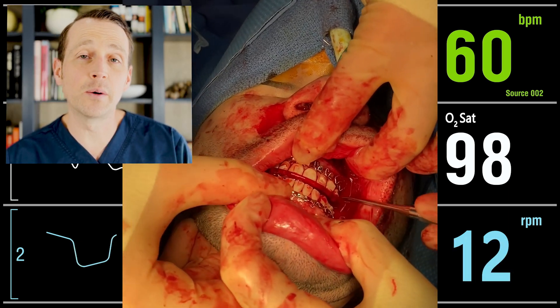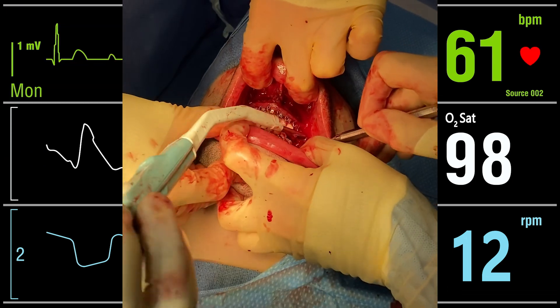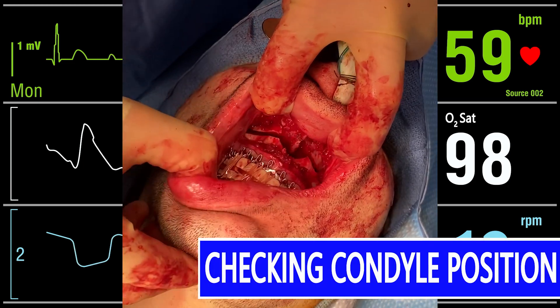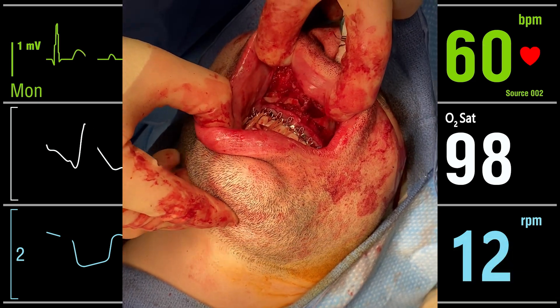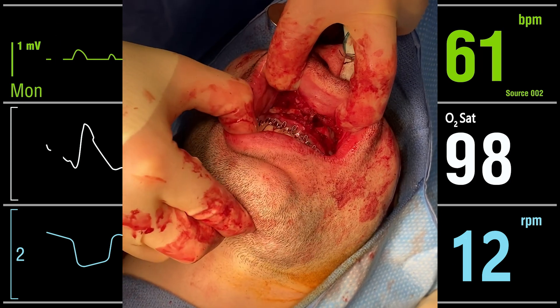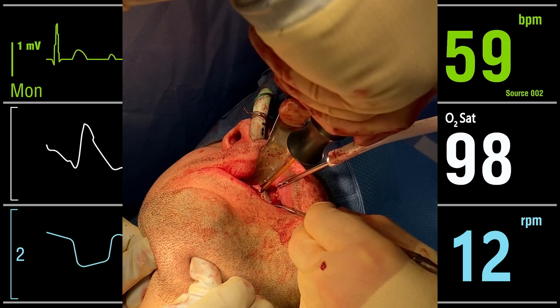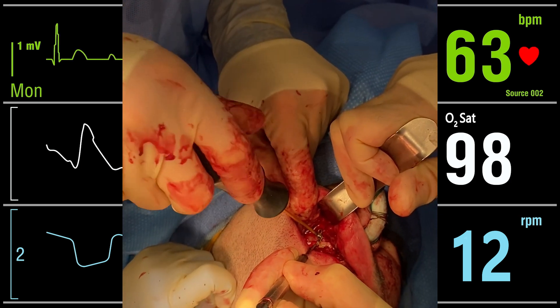I can advance the maxilla without resistance and it fits into the splint passively. I lock the maxilla and splint into place with heavy elastics and then fixate the maxilla in its new position with plates and screws. I place two plates at the piriform rim and two plates at the lateral maxillary buttress and secure them with 7mm screws.